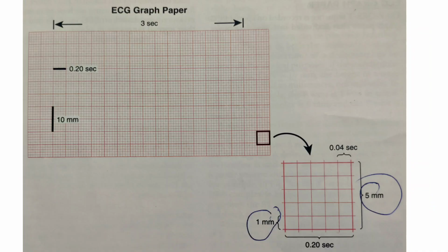Finally, let us understand ECG paper. The horizontal axis represents time. One small box equals 0.04 seconds. One large box equals 0.20 seconds. The vertical axis represents voltage. 10 millimeters equals 1 millivolt. The ECG machine is standardized so that the paper speed is 25 millimeters per second. 1 millivolt produces a 10 millimeter deflection. This standardization allows ECG recordings to be compared anywhere in the world.